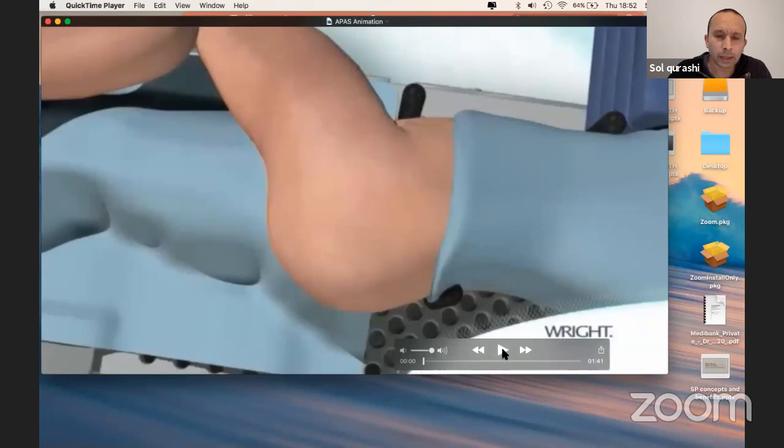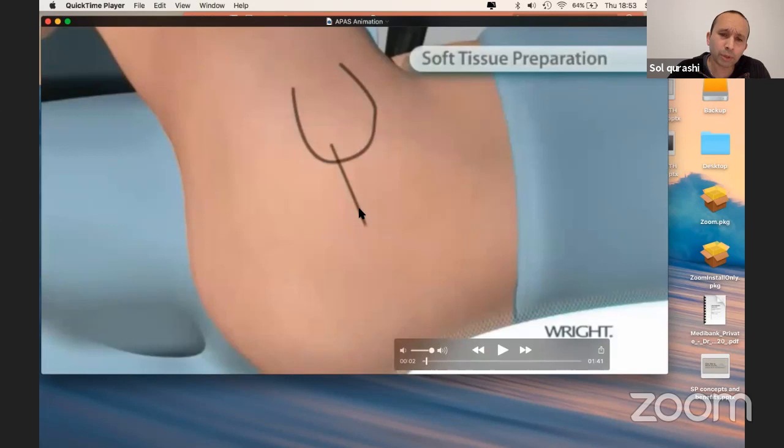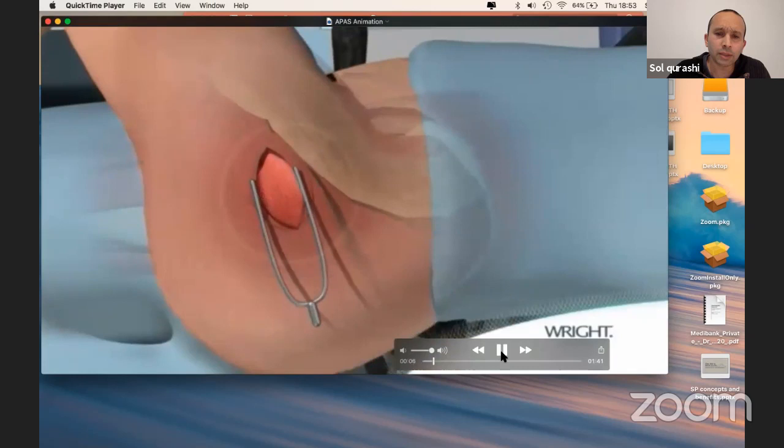Landmarks are your greater trochanter, so front and back of the greater trochanter. It's like the posterior approach incision, but probably just the top half of it. Once you do that, you get to the glute max fascia. I just cut the glute max fascia with my fingers or diathermy. Glute max, you separate with your fingers.